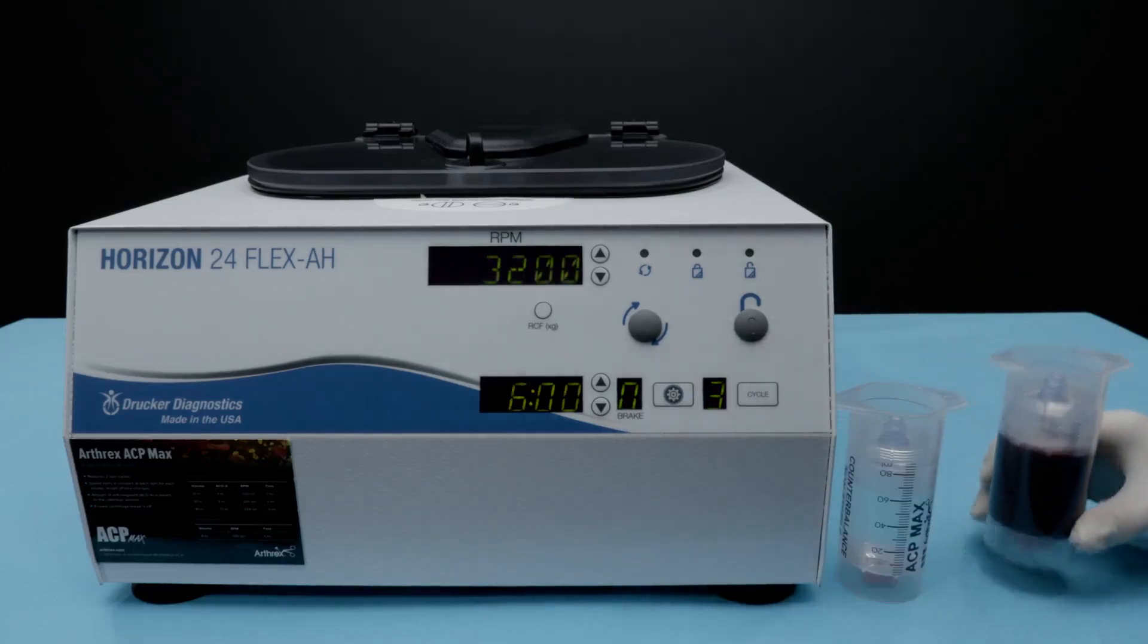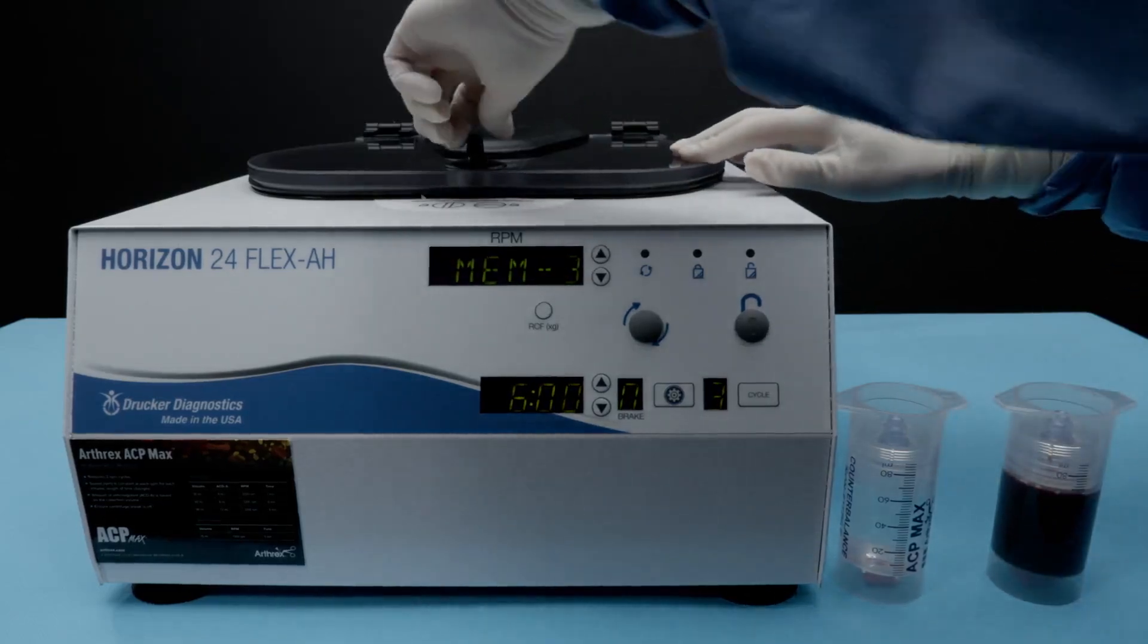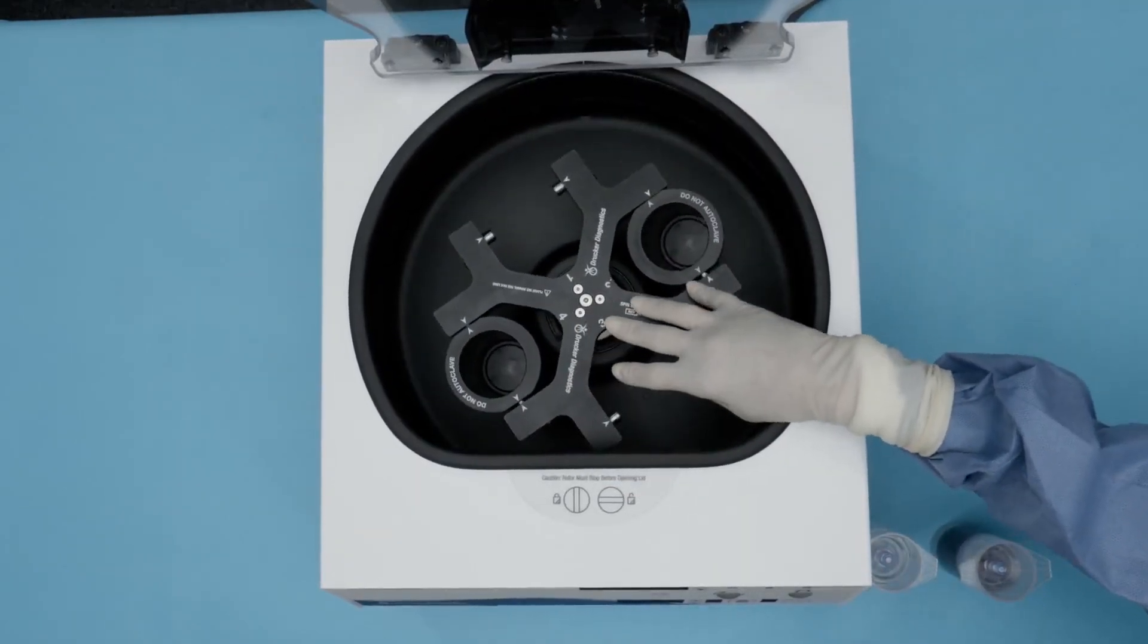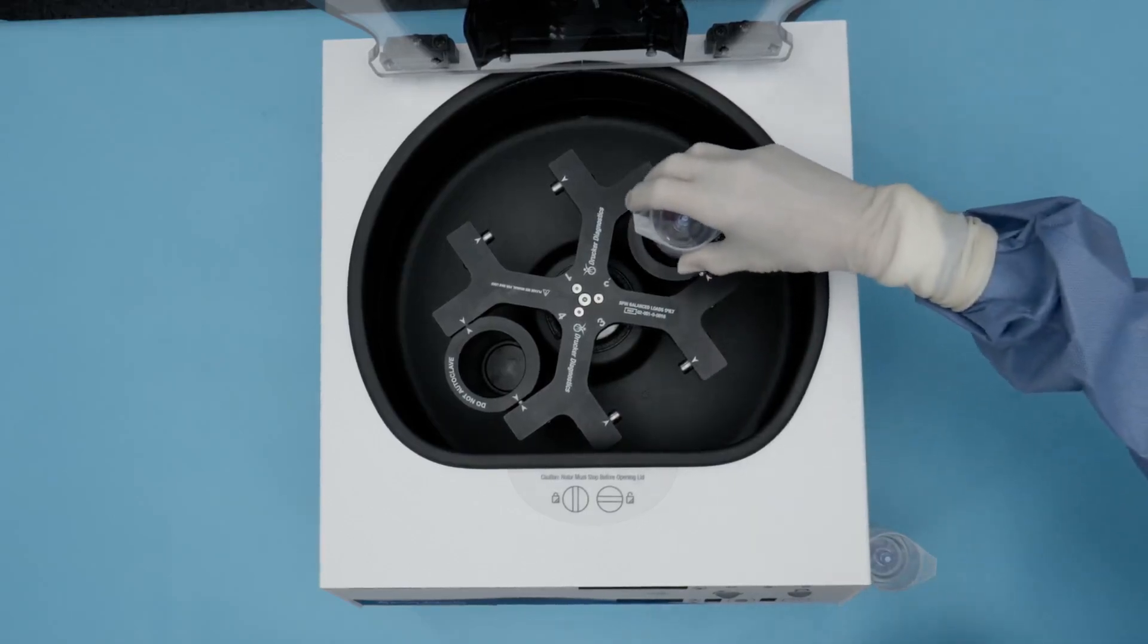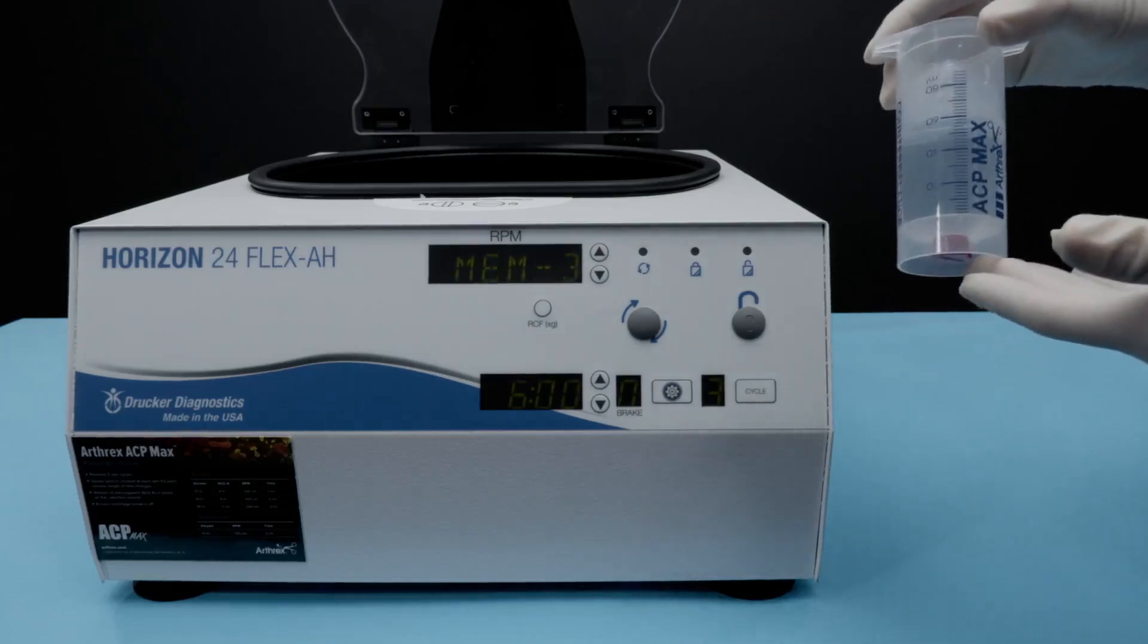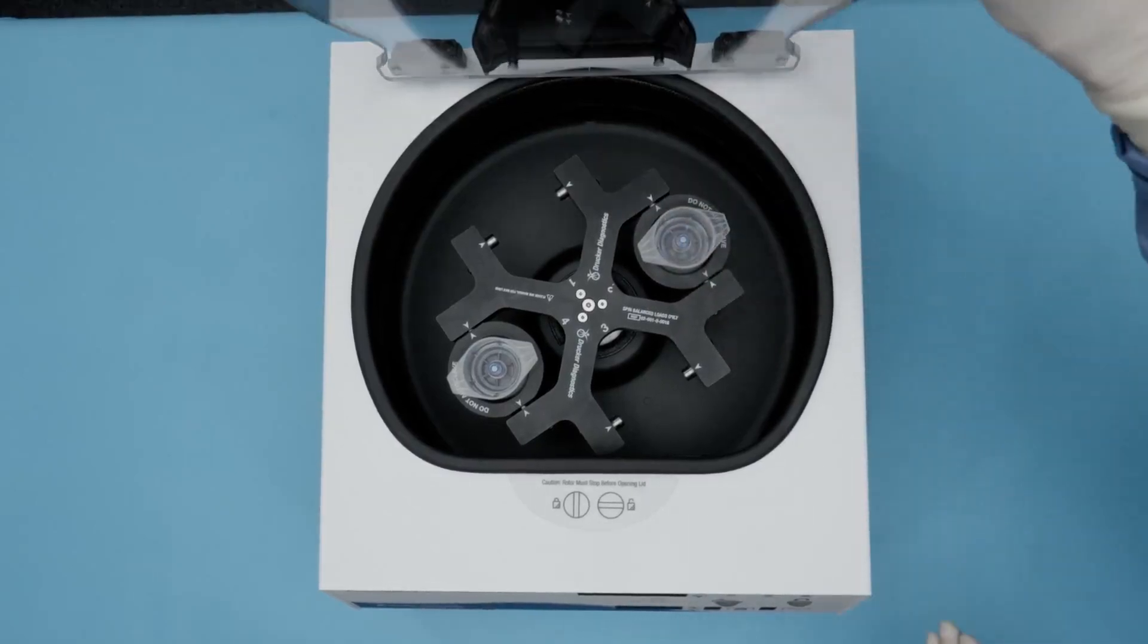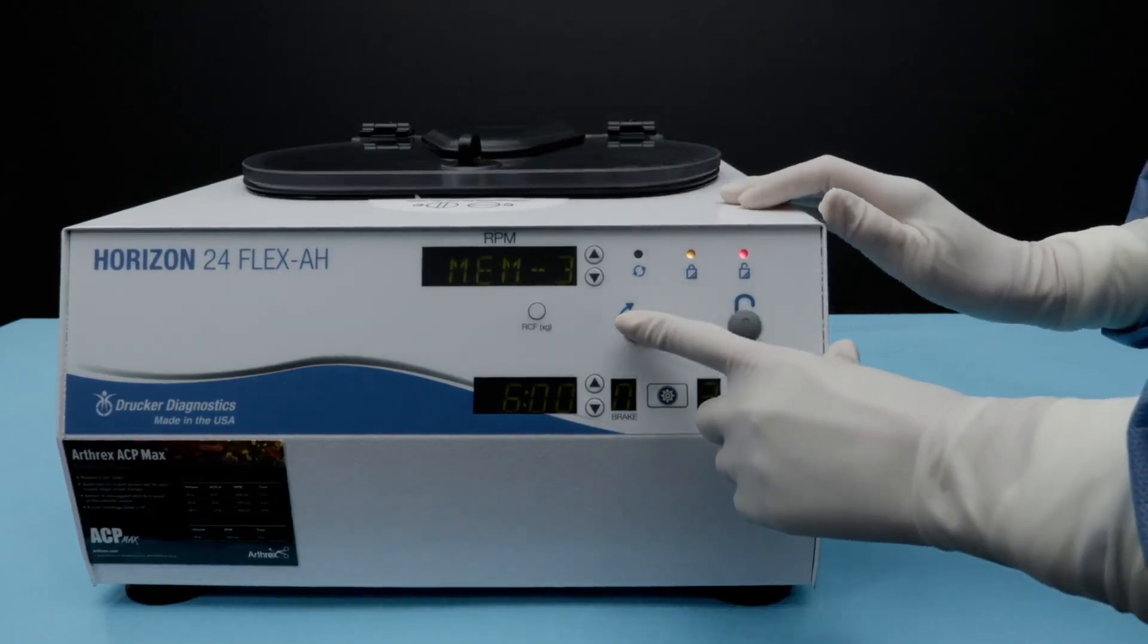For this demonstration, we are using 60 cc's of peripheral blood. We're going to open our centrifuge, unlock the centrifuge, then unlock the top of the centrifuge. There are two buckets contralateral to each other in the centrifuge. In one, you will place your ACP Max product for the first spin. In the other, you will place an equivalent volume on the other side of the centrifuge to counterbalance your ACP Max product. You then close the lid, lock the lid, and then you can start your first spin.